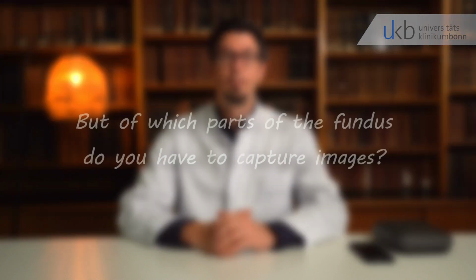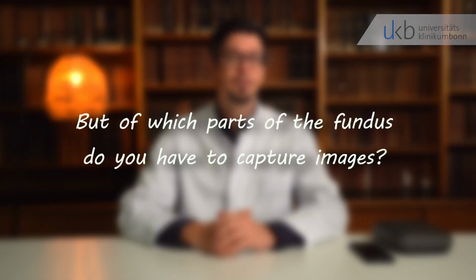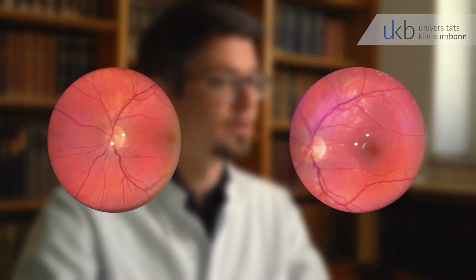Now you know how to get an image of the retina. But of which parts of the fundus do you have to capture images? For a full examination, you need to acquire images of 7 regions of the fundus. But before you start with the 7-field imaging, try to acquire images from the disc and the macula first. When you have mastered this task, acquire images according to the full 7-field imaging protocol.